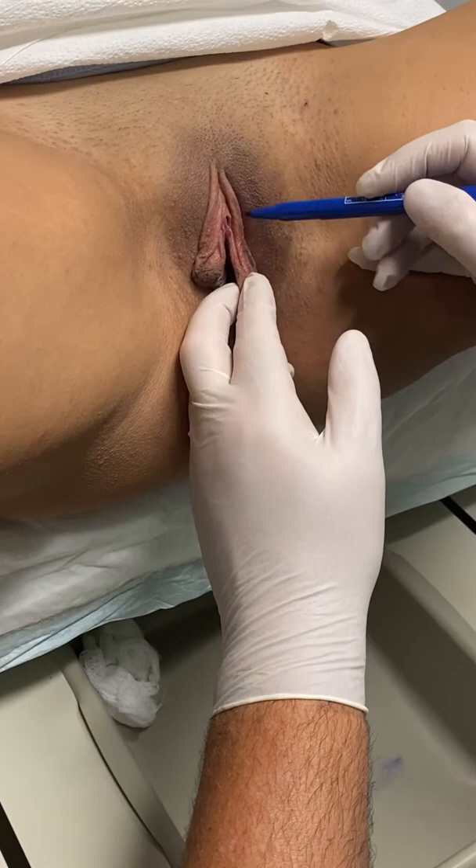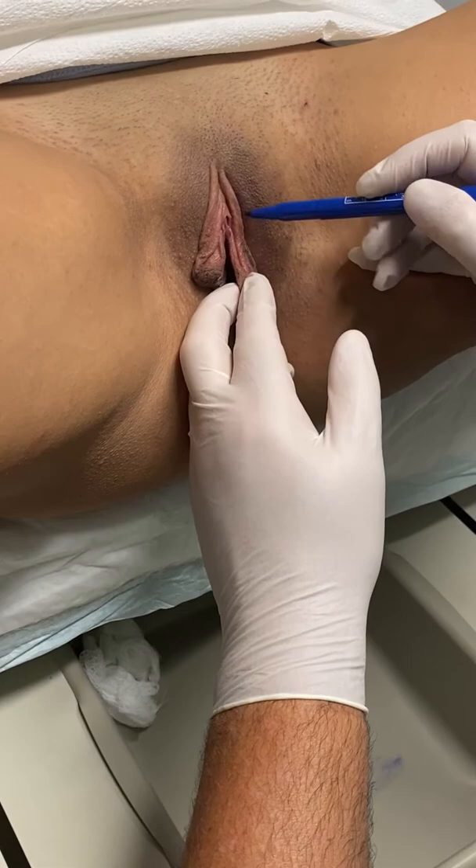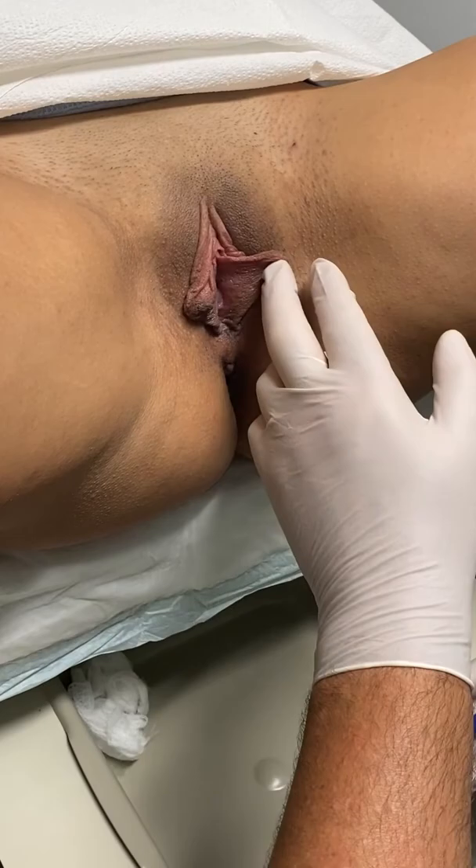What you also see is that you've got redundant tissue along the clitoral hood, so we want to make all of this disappear. I'm going to go ahead and make my incisions from here all the way down and really minimize the look of these labias and clitoral hood.